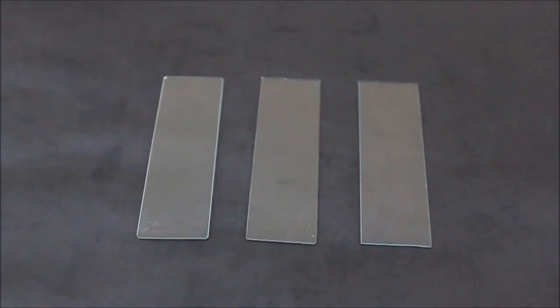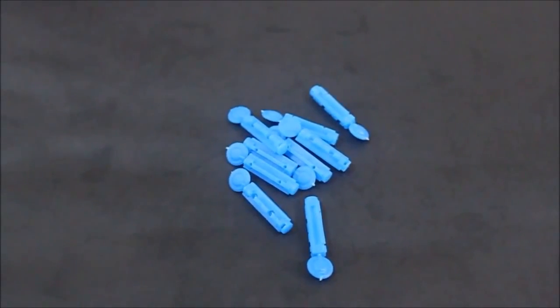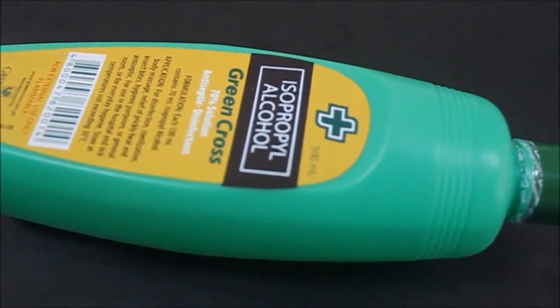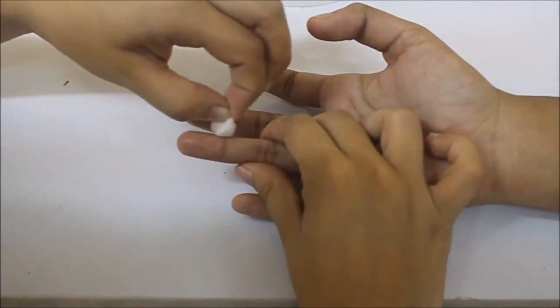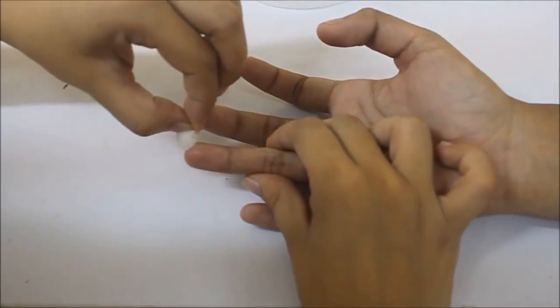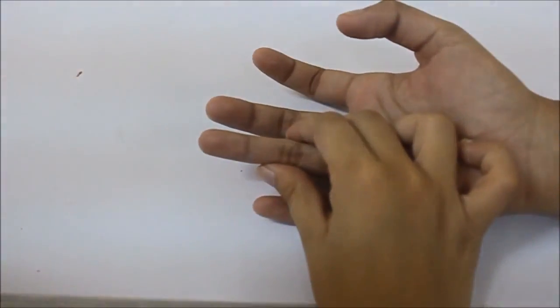Bleeding time is the time required for bleeding to stop. Some materials needed for the Duke's method are clean glass slide, lancet, timer, filter paper, 70% alcohol, and cotton. Sterilize the patient's middle finger with 70% alcohol. Allow about 1 minute to elapse so that the finger will dry.